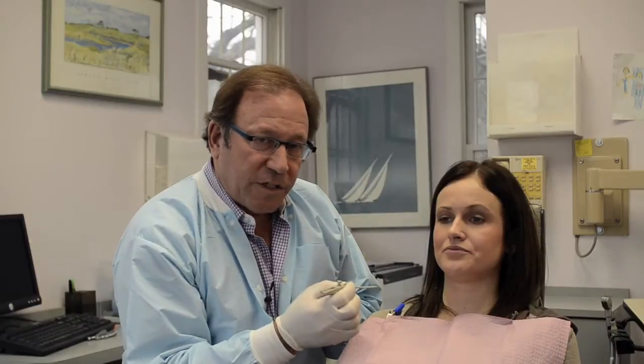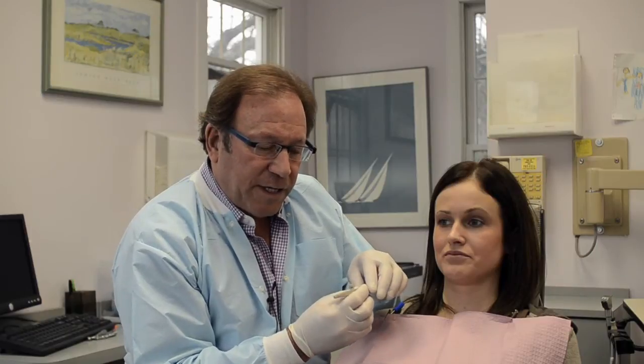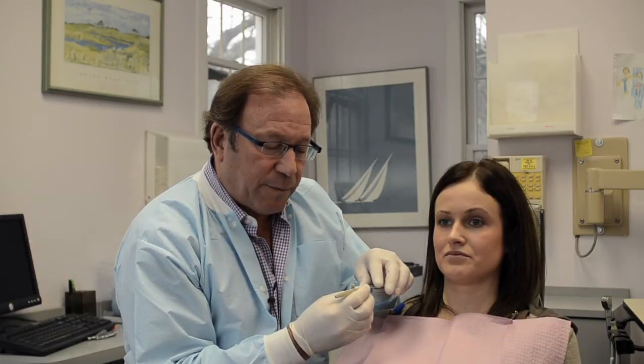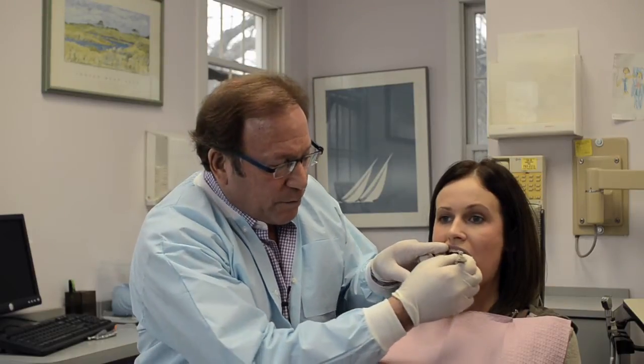You can start most patients between 60% and 70% of their range of motion forward in a protruded position. In this example, that would be 6 to 7 millimeters protruded. In this case, I want to go 60% forward. So we go from the -5, which, 6 millimeters forward of that, would put it at +1. I tighten that, and then we're going to place it in her mouth.